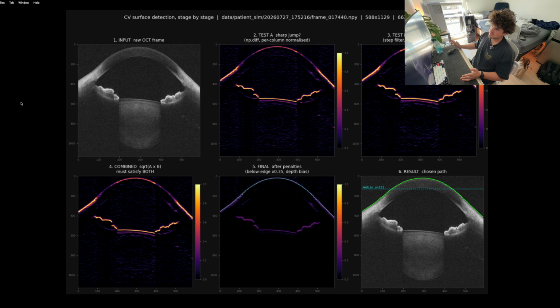And so all of this detection is represented as a scoring system. As each pixel is split up, we score the pixels as a float from 0 to 1, 1 being the most probable surface detection, 0 being probably not a surface, open air, don't worry about it. So imagine this entire 2D data structure where each pixel isn't a color value, it's just a score from 0 to 1. Right off the bat, we go into our first test where we're looking for where is the most aggressive jump from a dark to light colored pixel. It's going to be these regions. And then we check also, does it stay consistent? The answer is yes. You can see these lines are a little thicker. So both conditions are satisfied.